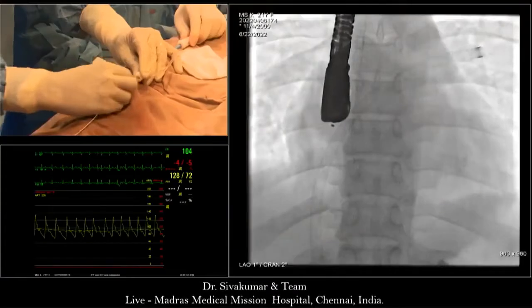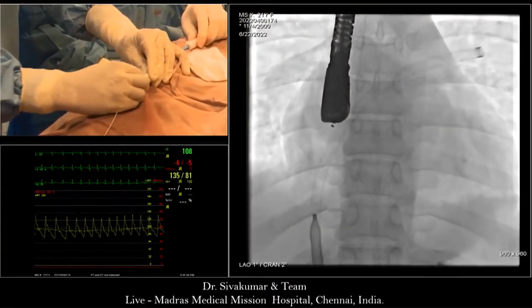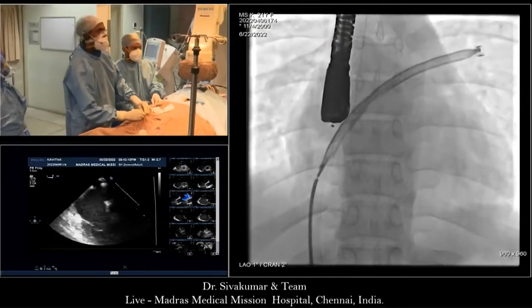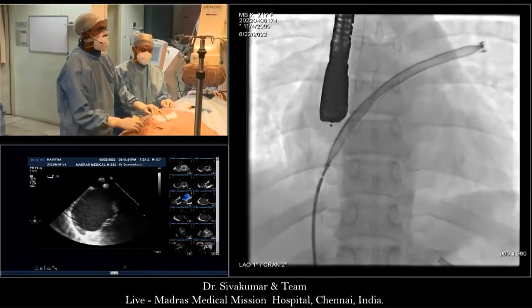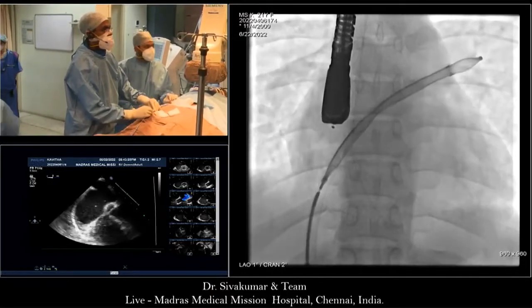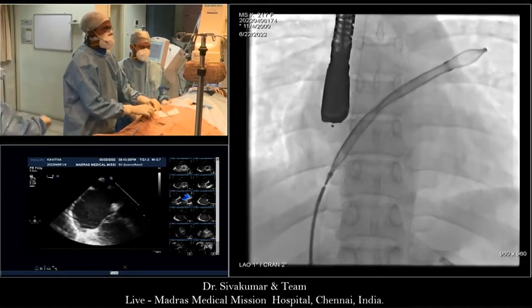The old one. So Shiva, when you do this bit, I was just going to ask you, that's what I was asking before, talk about that pulmonary vein deployment, what hand movements you make to pull, push, what? Okay, now keep showing 50% my hands also.